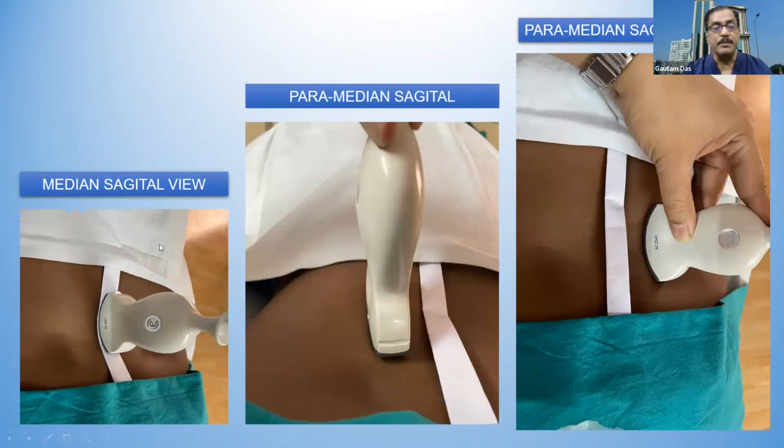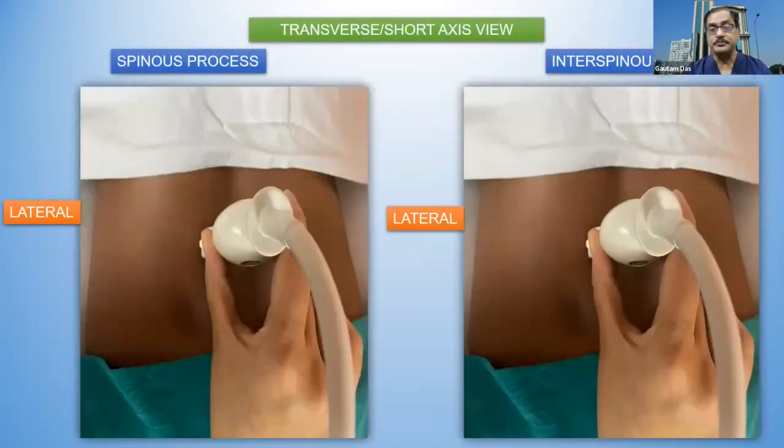As for the position of the probe, there are three important views. One is the median sagittal view, where we put the probe exactly on the midline. There we'll be able to see the spinous process and the supraspinous and interspinous ligaments. Then the paramedian sagittal, where we'll see the laminar view, and the paramedian sagittal oblique, where we'll see the interlaminar space nicely. We'll also see the transverse axis view, where one probe is placed over the spinous process and another in between the two spinous processes.